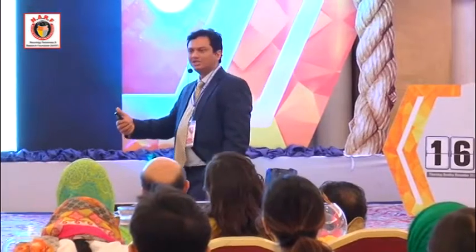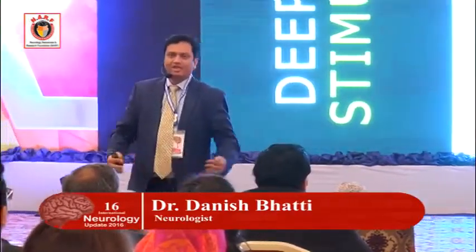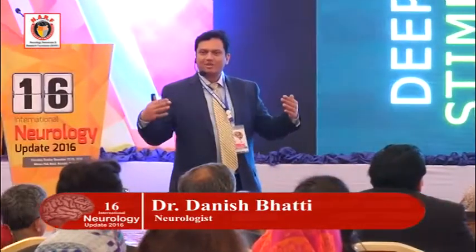You can change the voltage of the current, you can change the frequency of the current, you can change the width of the pulse of each frequency of the current. So you have 3 different parameters. Each parameter has a couple of dozen or more options available. Which means that if you add all these combinations together, you have over 6,000 possible combinations.